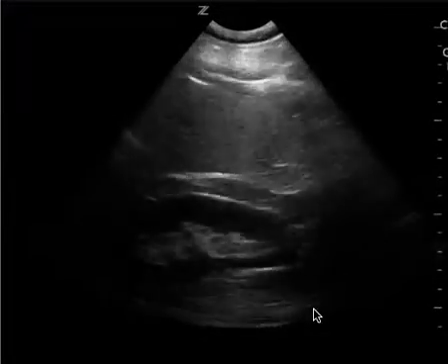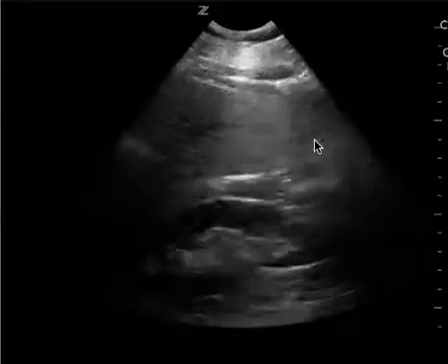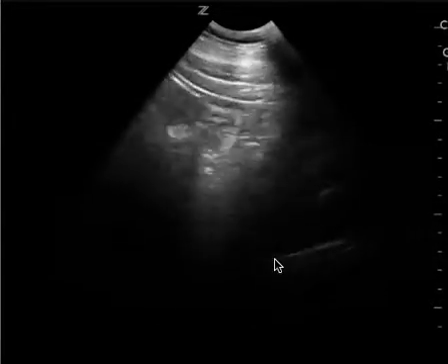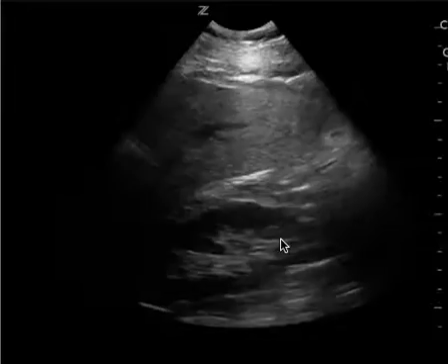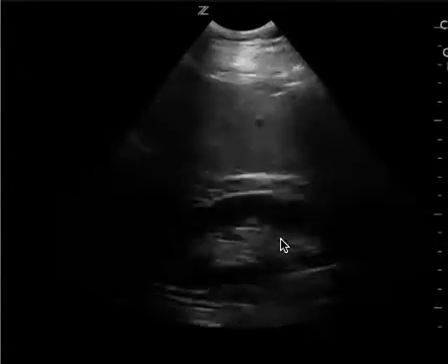This is a FAST exam. This is the right upper quadrant. You can see the kidney very well and you can see the liver tip. The only thing that I want to see when you're looking at the right upper quadrant is the diaphragm, the spine, and getting the entire Morrison's pouch.